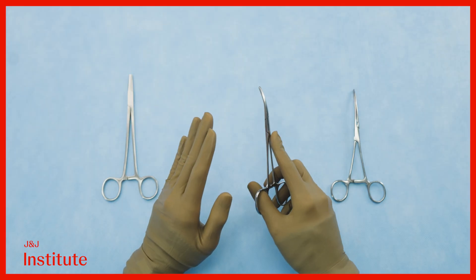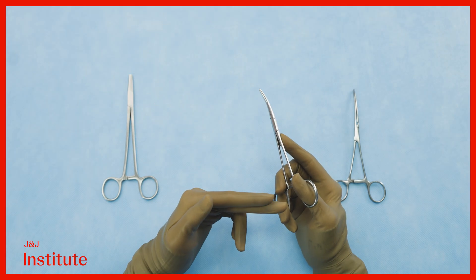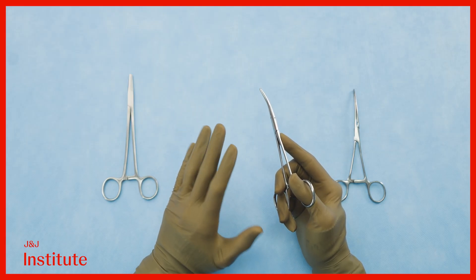Do not concern yourself too much with the exact names of the instruments. The same instrument may go by several names across the world.